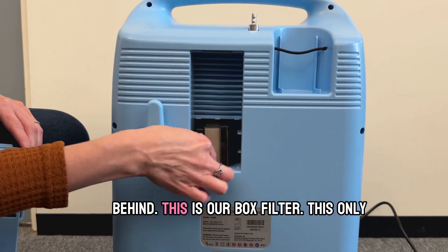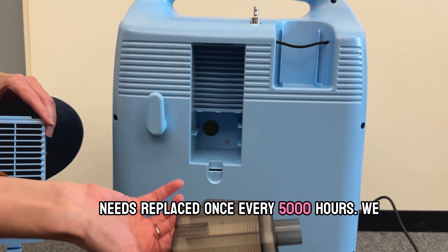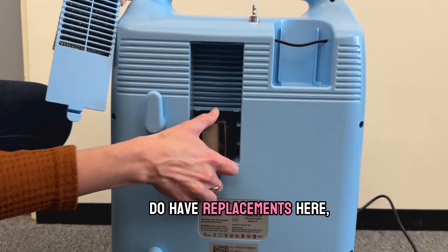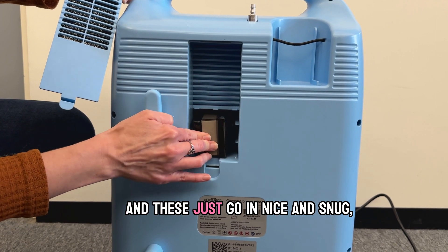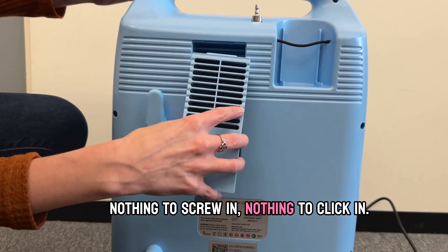Behind this is our box filter. This only needs to be replaced once every 5,000 hours. We do have replacements here and these just go in nice and snug — nothing to screw in, nothing to click in.